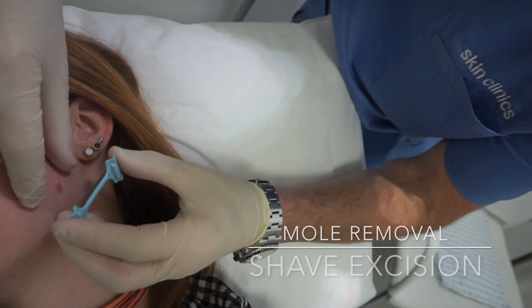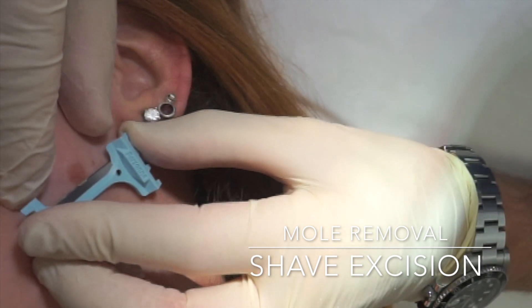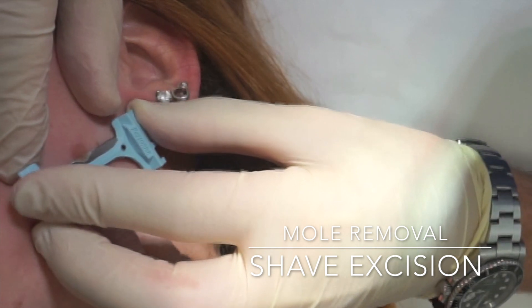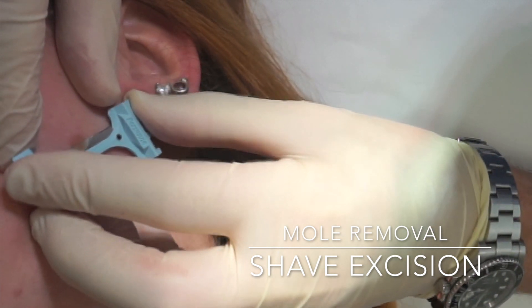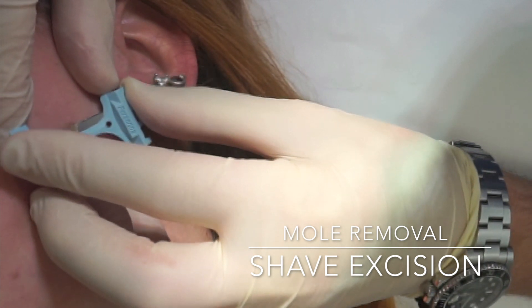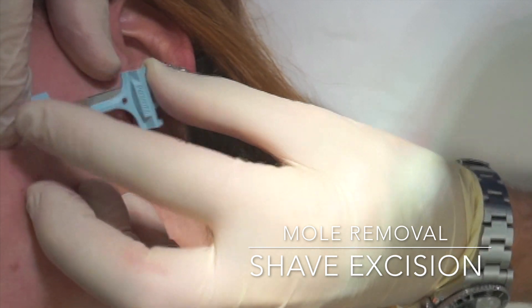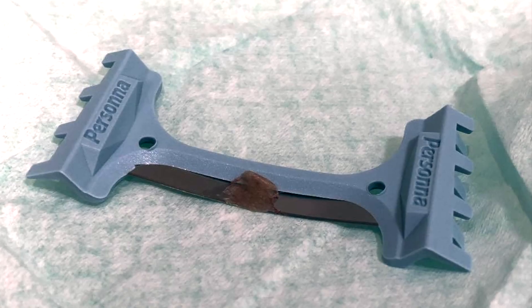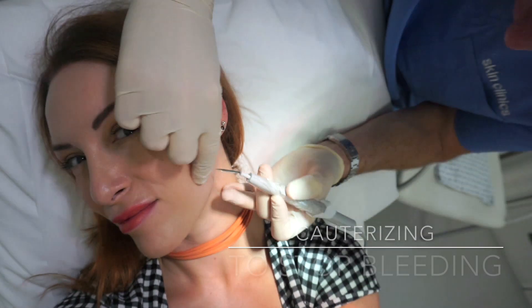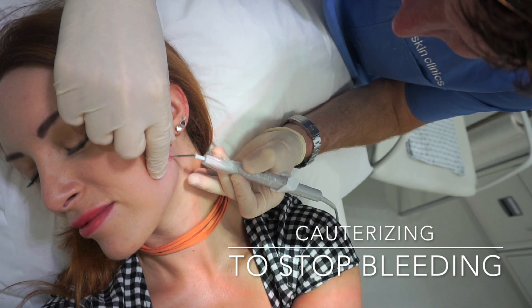This is nice and quick and simple. It literally just planes off very superficially. The beauty of this is we can just take it as thin as we want. It's actually a little friend gone. As you can see there's very little bleeding — the little bits that are there are virtually all tied off.